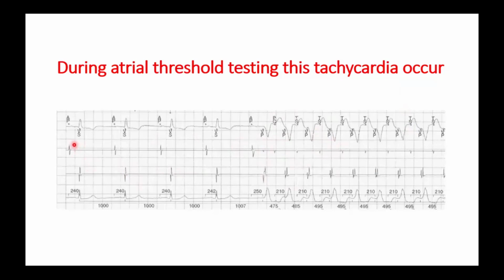Muhammad Bitar, please. Open your microphone, Bitar. I think, Dr. Mervat, when you pace the atrium and sense the atrium and the ventricle channel, the PMT will occur. So you should increase the PVARP, I think.